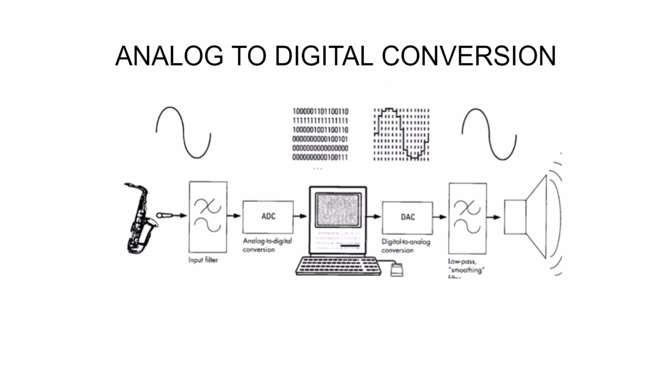It's a very similar process when recording music. Sound waves are created by the saxophone here in analog form. The ADC is sampling sound waves and assigns varying notes or volumes a numerical value before it goes into the computer. In order to be projected onto the monitor, digitization is required, but in order for you to hear the sound on the speakers later, it actually undergoes another step which turns the digital signal into audio waves, in analog form again, for you to hear with your ears.